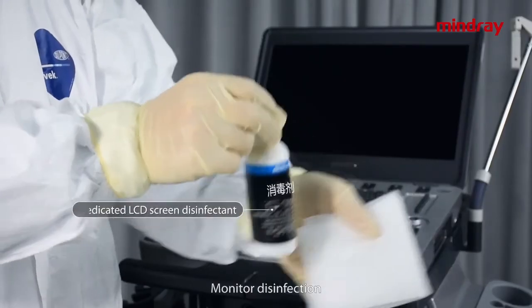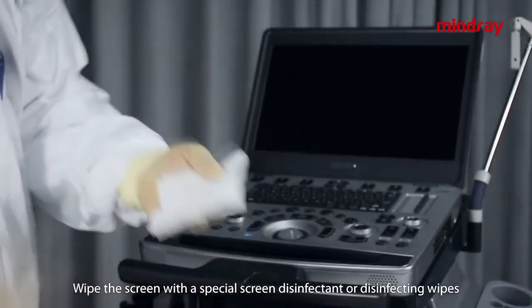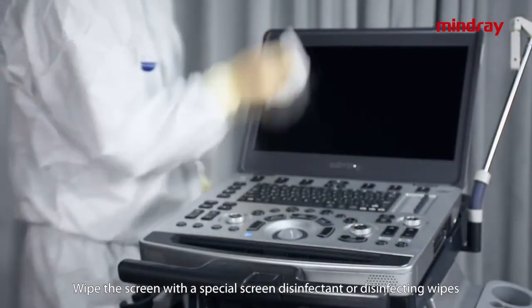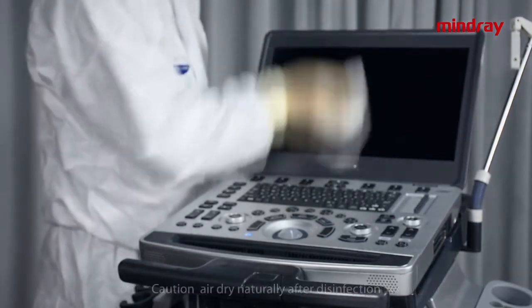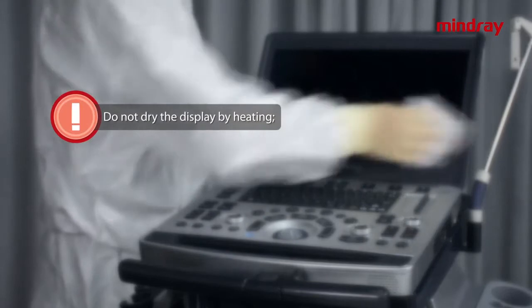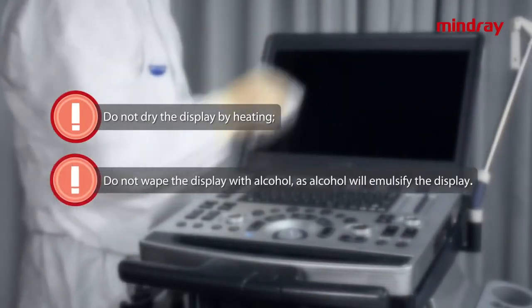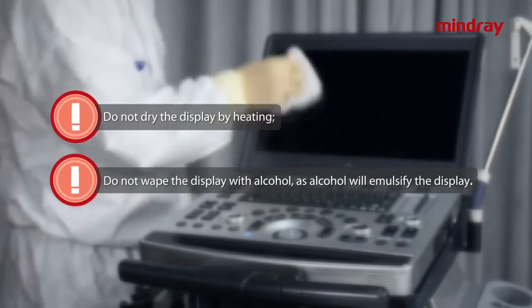The following will demonstrate the disinfection operations of components other than the probes. Monitor disinfection. Wipe the screen with a special screen disinfectant or disinfecting wipes. Caution: air dry naturally after disinfection. Do not dry the display by heating. Do not wipe the display with alcohol, as alcohol will emulsify the display.